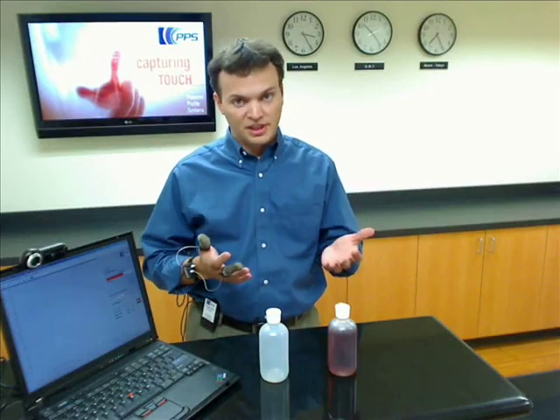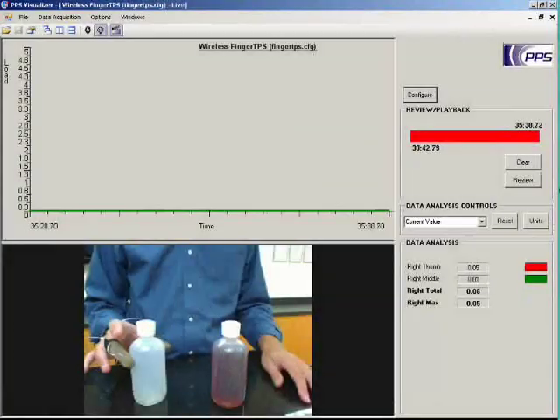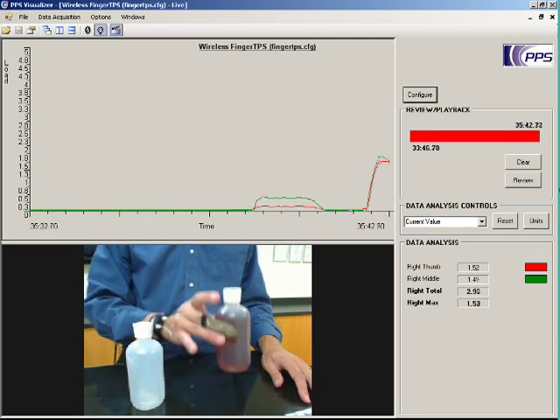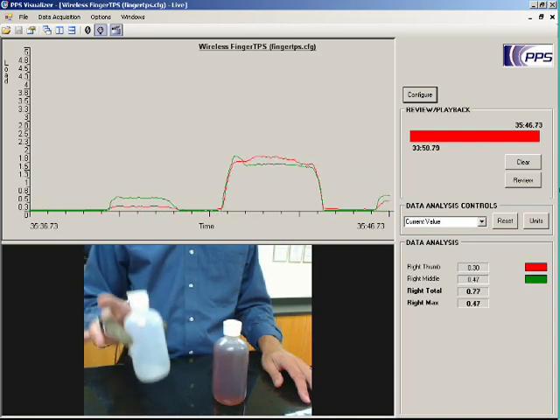Now that we're calibrated, we can begin collecting data. As an example, I have two bottles here — one full of liquid, the other one empty. Watch how different the pressures are as I lift the empty bottle and then the full bottle. You can also use the integrated video feature in our software to correlate actual actions with the tactile data that's collected.